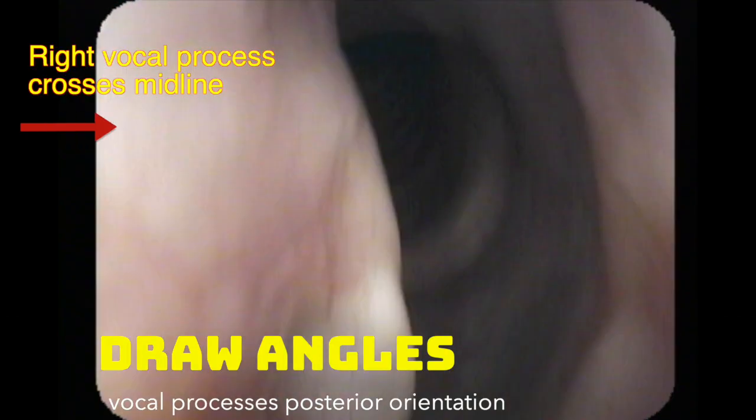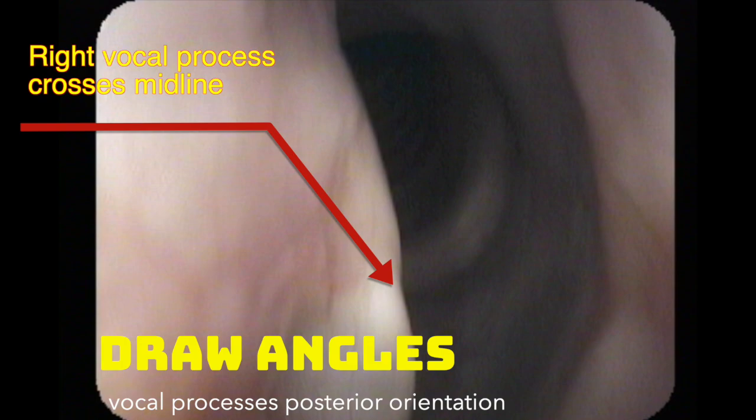Look at the lateral cricoarytenoid muscle, the LCA muscle, when it's acting alone. So that will be during phonation and low pitch. And when we slow our video recording down, we gain a perspective on how much compensation is actually coming from the right side. The right vocal process is actually pushing past the midline.